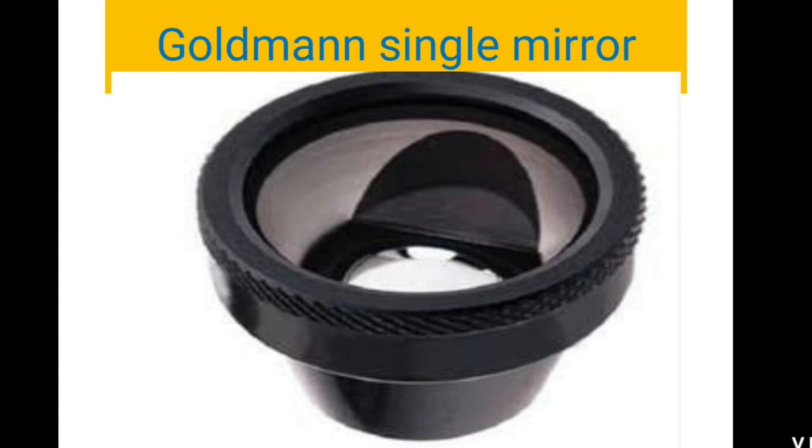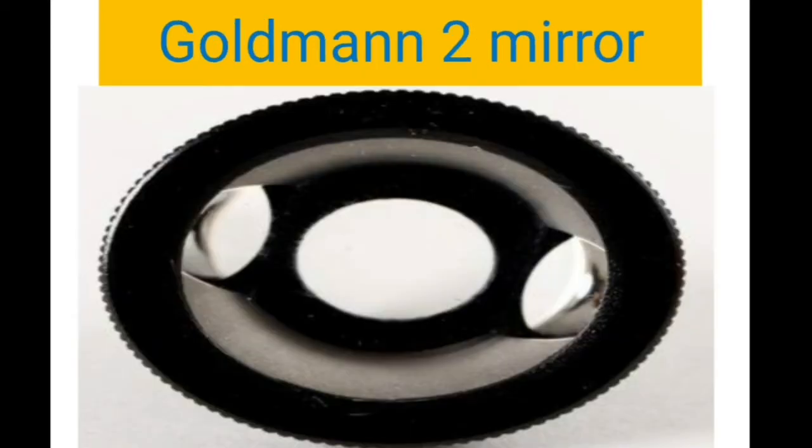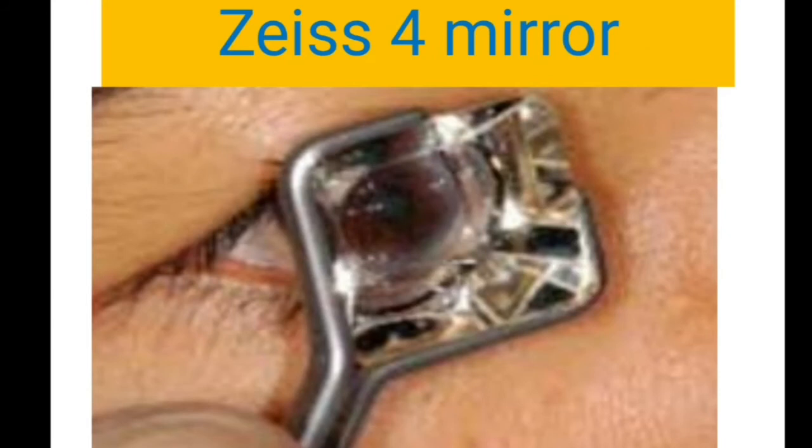Next one is the Goldmann single mirror, where we have only a single mirror and it is inclined at an angle of 62 degrees. We have to rotate this single mirror almost 3 times to cover all the quadrants and to visualize all the angle structures. Next is Goldmann's 2 mirror, where we have 2 mirrors, again inclined at 62 degrees. The advantage is if we just move it once like this, we will be examining all 4 quadrants of the angle structures.